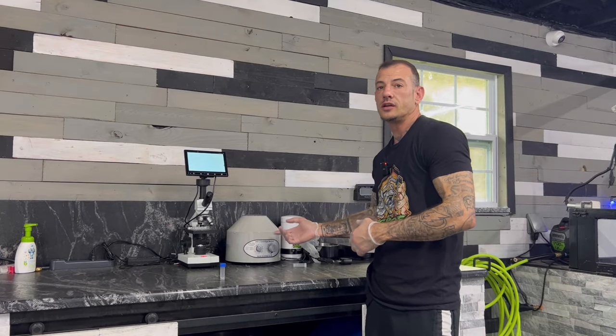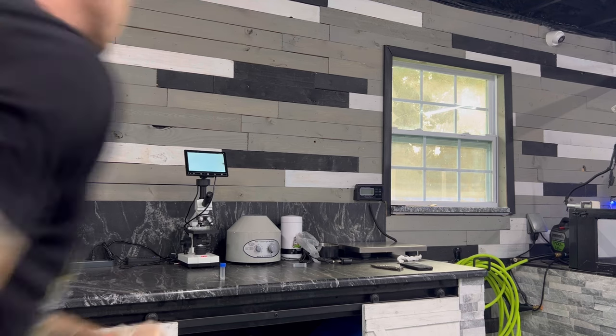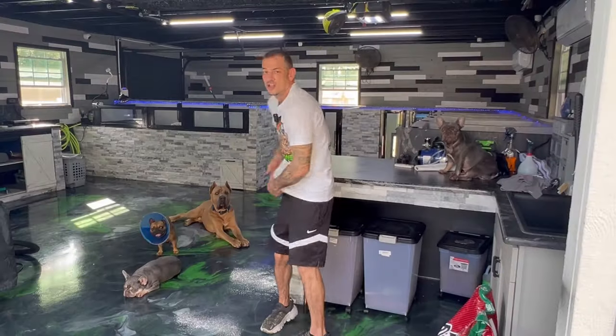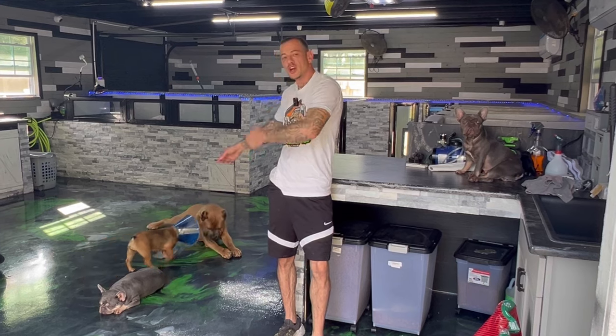If you don't have a centrifuge already, check out BigBoneBulldogs.com. On this episode, I'm going to show you how to collect semen from your male, and I'm going to show you on Big Drago here. It's going to make it a lot easier than showing you on a little Frenchie.